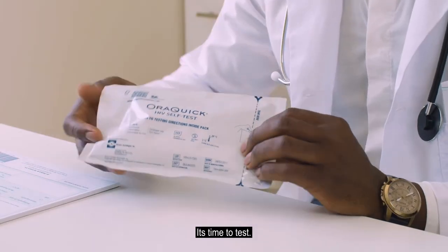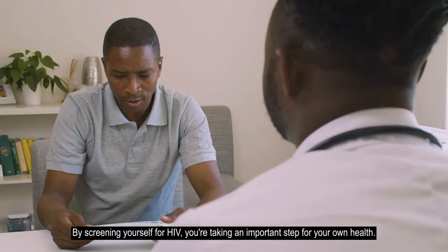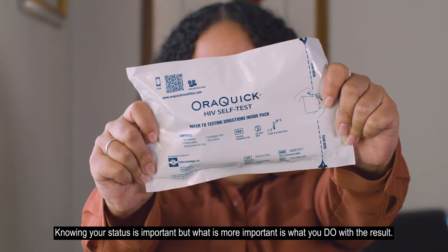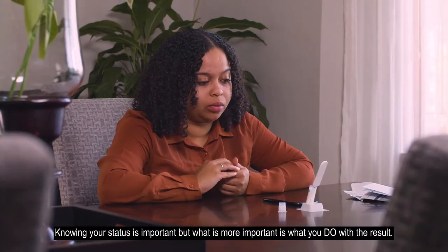It's time to test. By screening yourself for HIV, you're taking an important step for your own health. Knowing your status is important, but what is more important is what you do with the result.